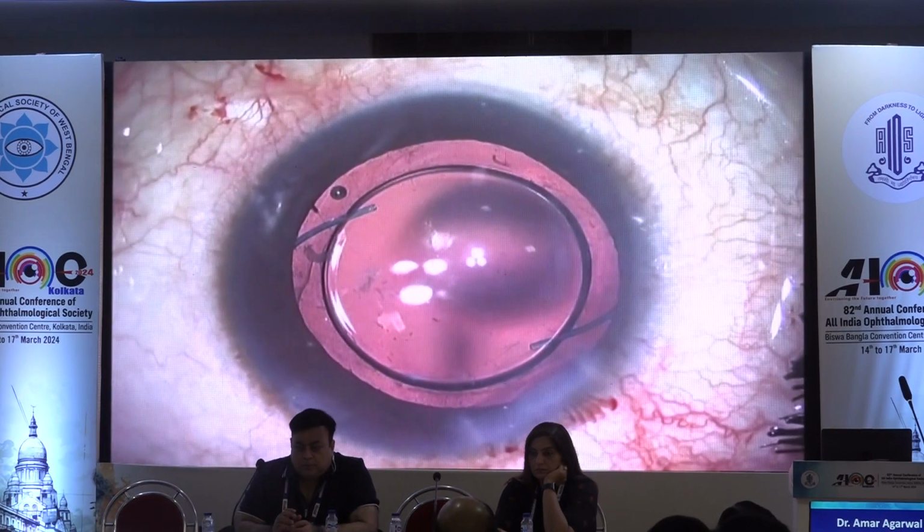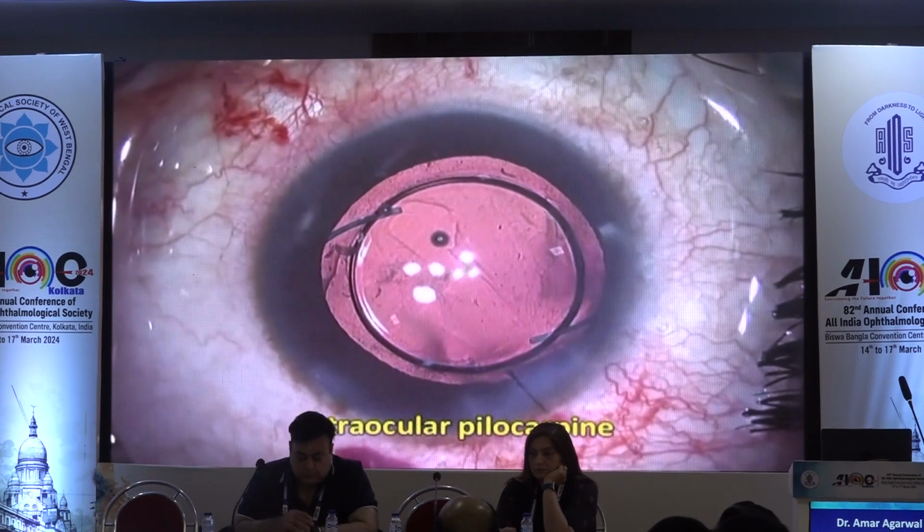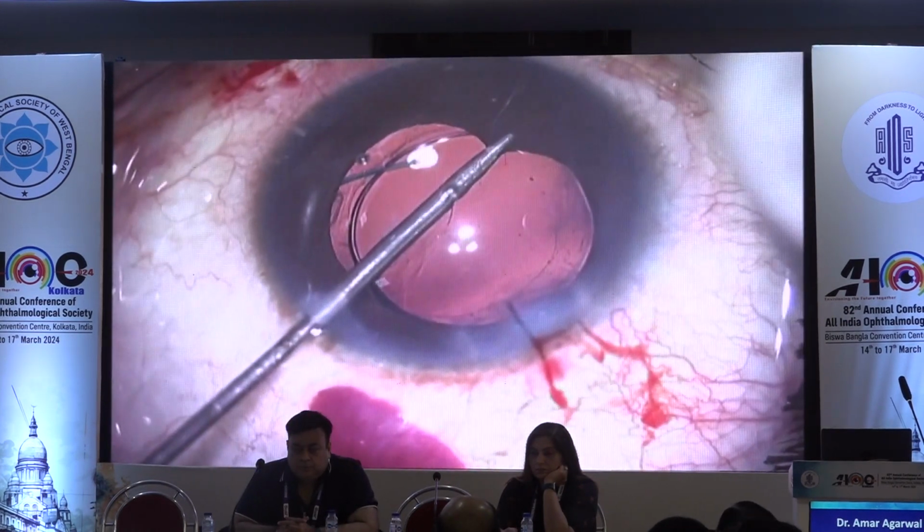Now I put a monofocal for him, Virendra. I have not put a multifocal for him because I do not know, again I will have some higher order aberrations coming in my hand. So now what I am doing is, I am doing the pupilloplasty.